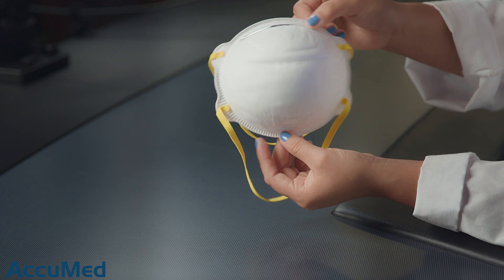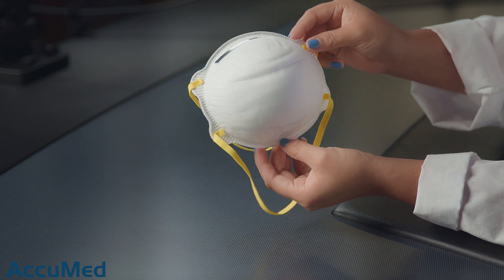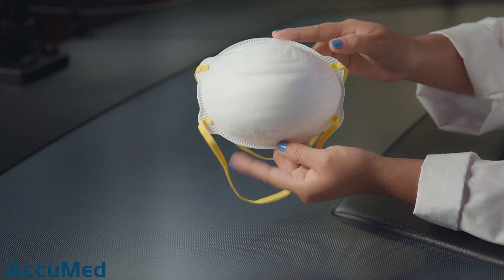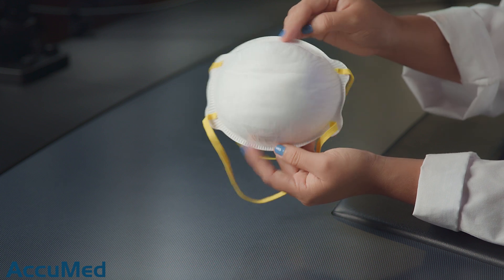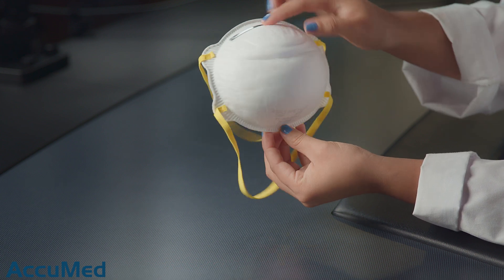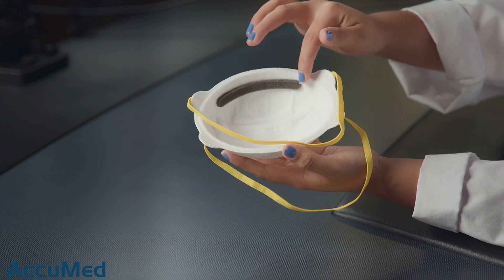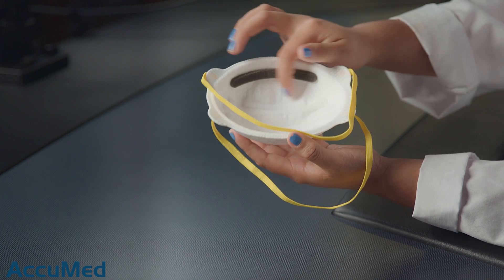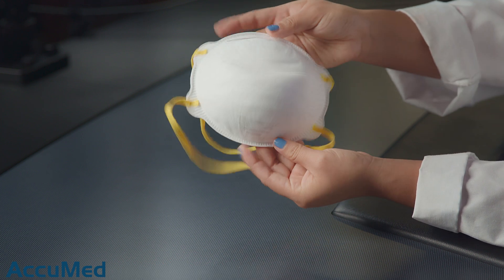Let's take a look at these respirators before we run them through our TSI machine. The first thing I notice is the texture is very different compared to other cup styles we've reviewed — this is more of a soft cup style. They do come a little wrinkled. They seem very short lengthwise. From the inside, they have a nose foam and a nose wire.